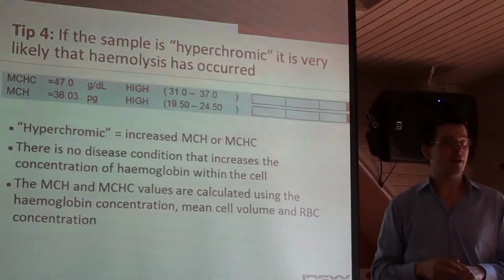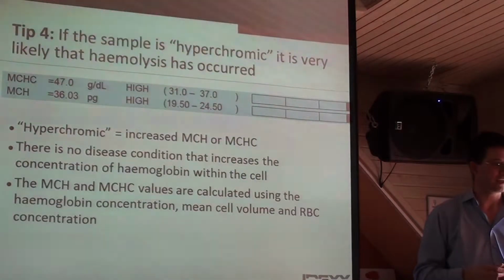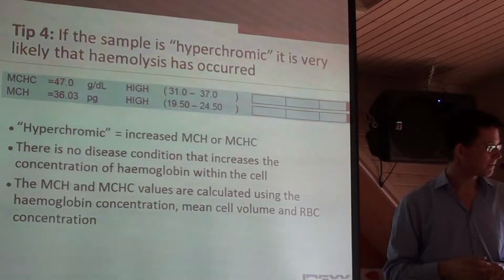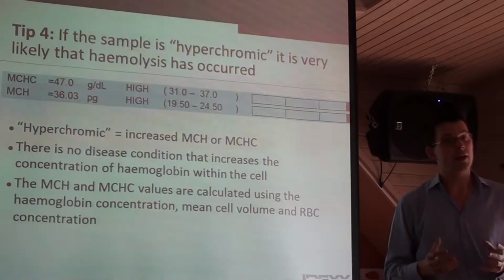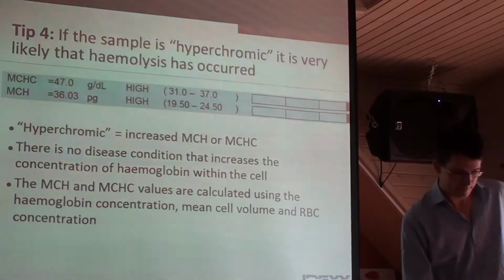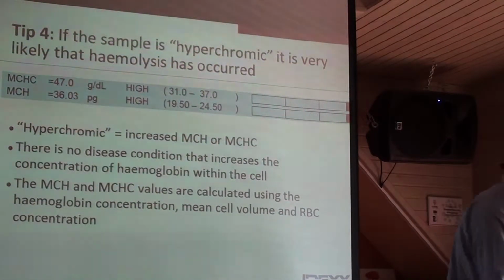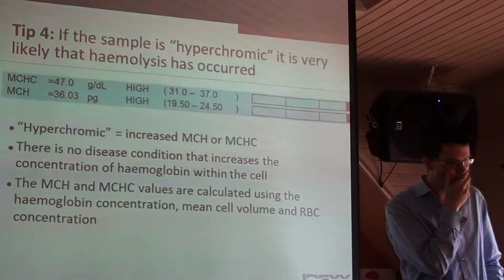If you see these values being high mainly on feline samples, you probably need to review your sampling technique. However, cat blood samples are always going to be difficult, and a proportion of your samples will always have these values high.